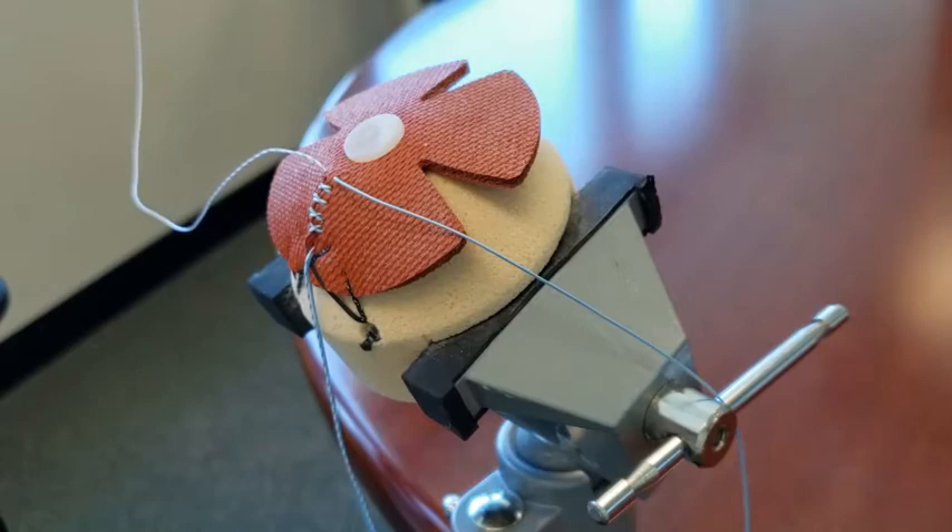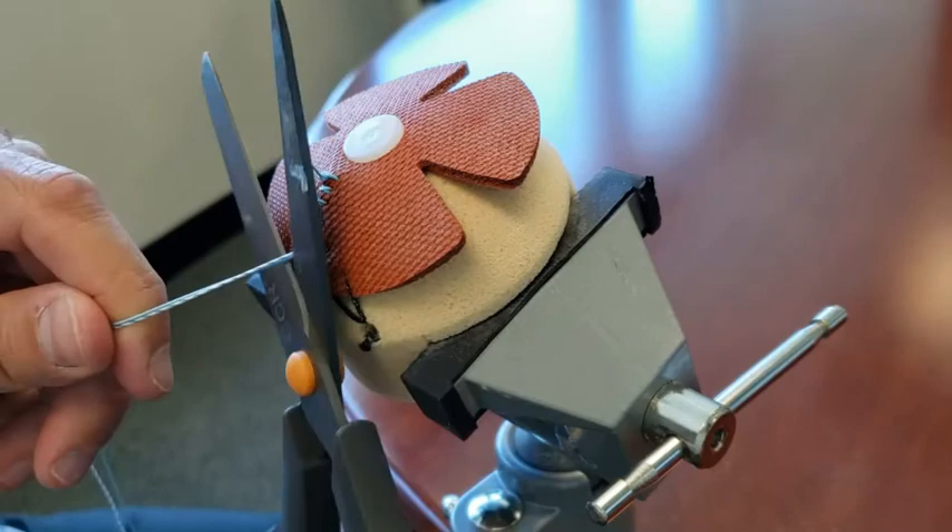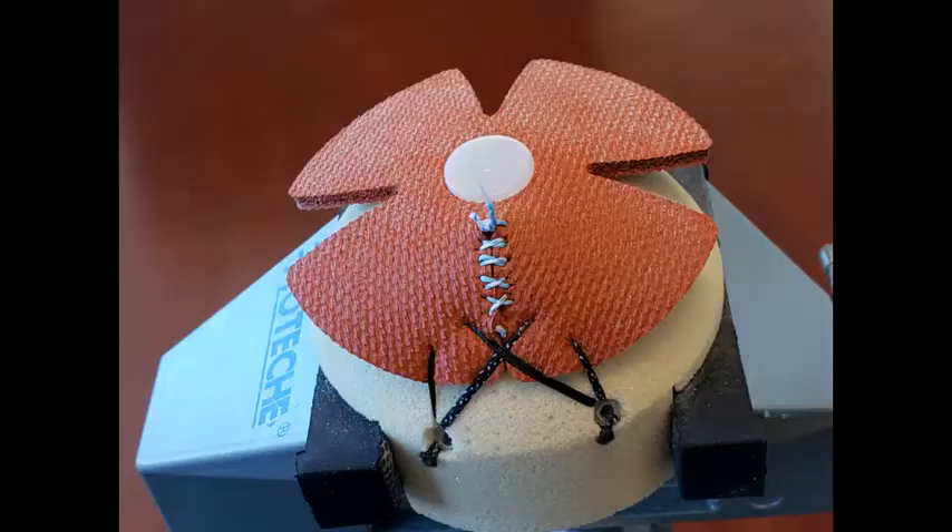Once complete, you can then start tying the knot at the upper part of the incision by throwing three to four knot throws. When you're done, you can cut any unused limbs. You can see here your final construct is complete and your tendon is laying down nicely.